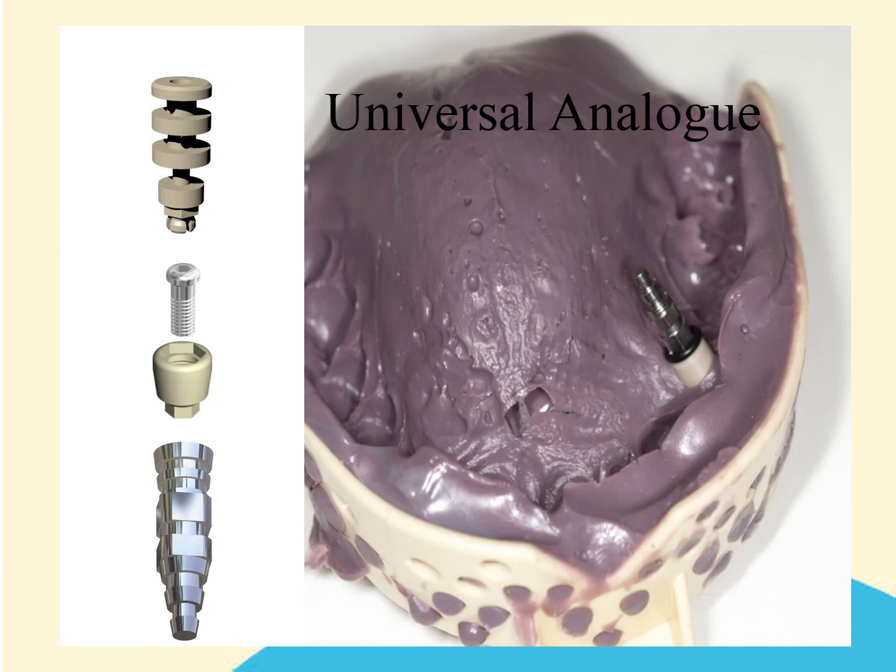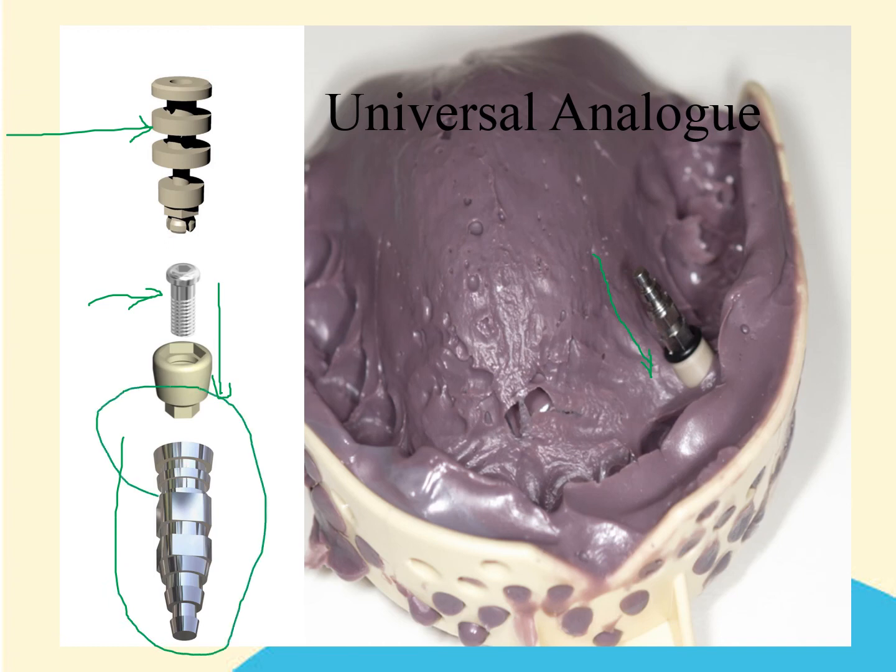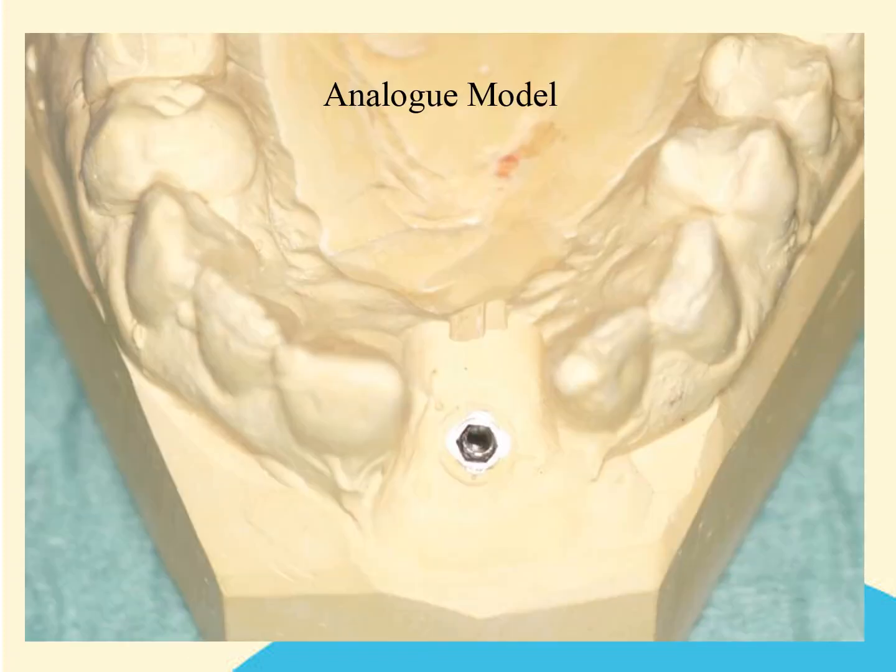In order to produce the analog, you will need the clicking top — which is now locked into the impression material — and the low profile screw, which the laboratory will use to secure the base to the analog. This whole assembly is completed by pushing the base onto the male part of the clicking top, which is retained in the impression material. The laboratory should then be able to produce a soft tissue analog model in the normal way.